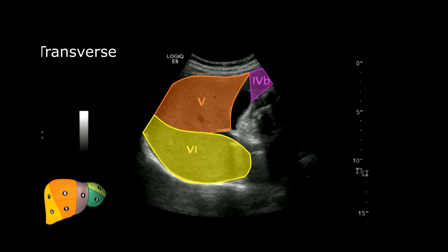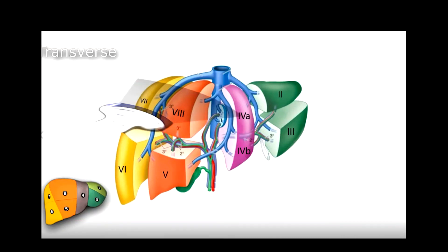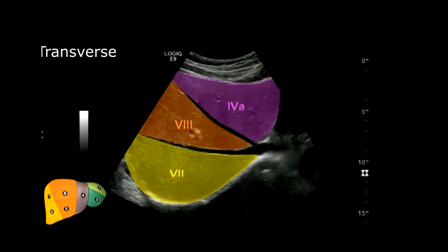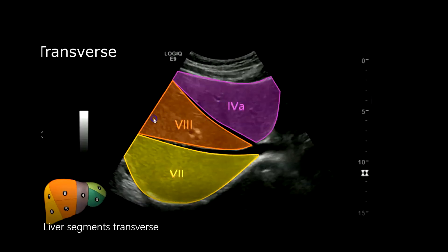Scanning the right lobe of the liver in transverse, we've got the gallbladder, segment 4b, 5, and 6 — so right around this area. Now scanning the superior segment of the right lobe in transverse, you have your hepatic veins visible. Here you have segments 4a, 8, and 7, scanning around right here. You'll see that the middle hepatic vein separates 4a from 8, and the right hepatic vein separates 8 from segment 7.